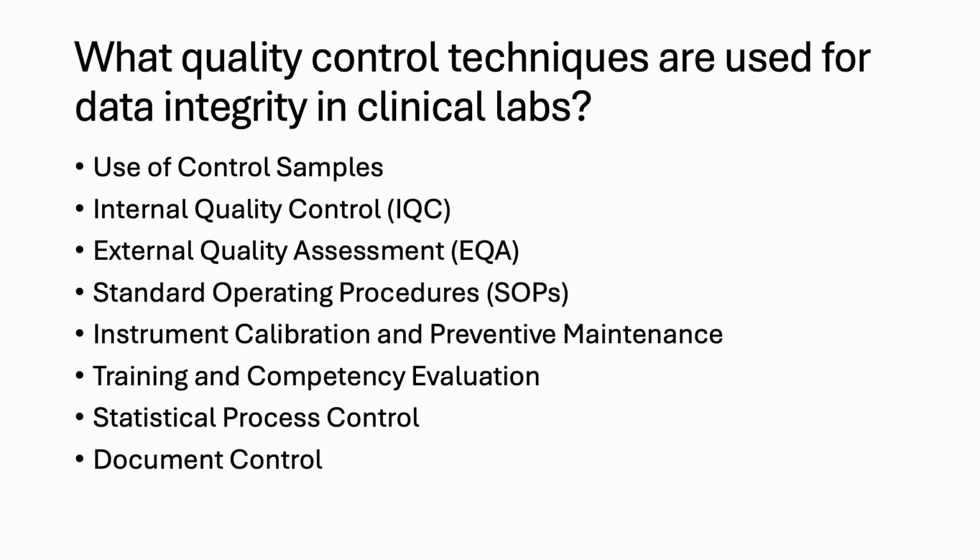Instrument calibration and preventive maintenance. Regularly scheduled calibration and maintenance of laboratory equipment to ensure it functions correctly. Training and competency evaluation. Ensuring that laboratory staff are adequately trained and regularly assessed for proficiency.